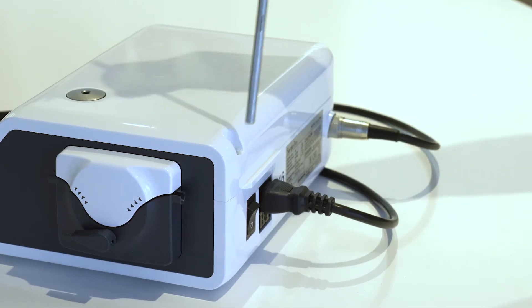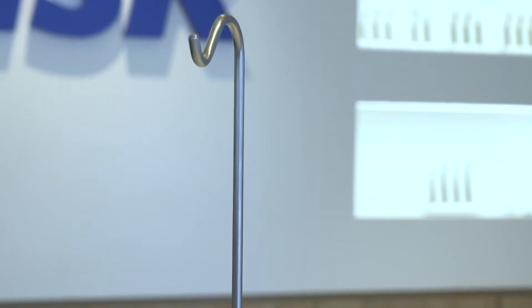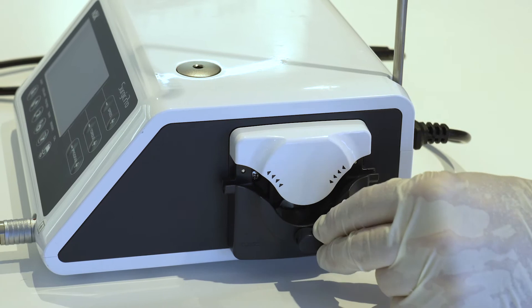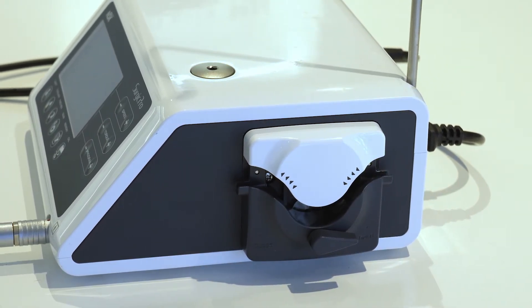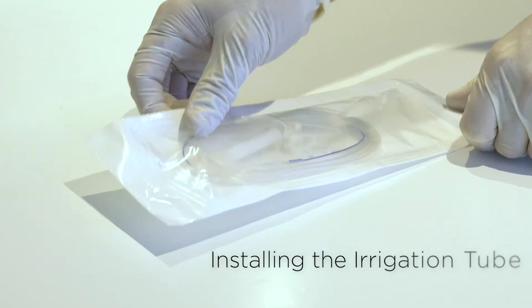Mount the coolant solution hanger post onto the holder on the control unit. Ensure the pump cover lever is in the open position with the irrigation tube needle towards the backside of the control unit. Use only NSK tubing.